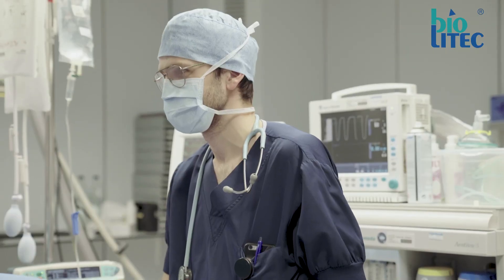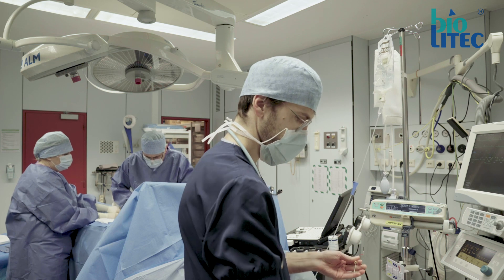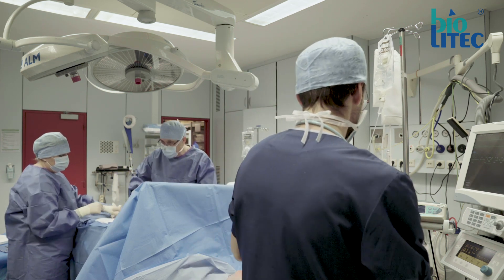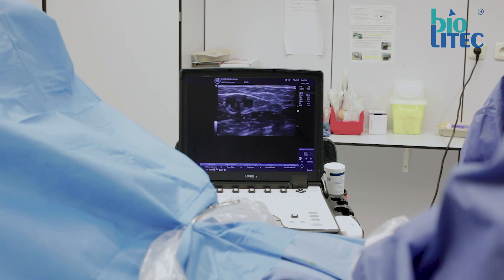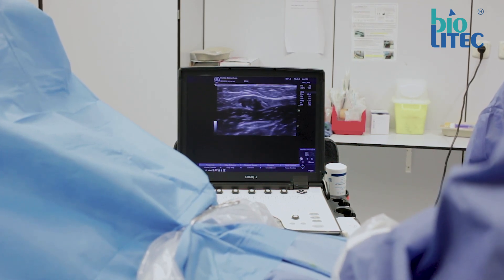In most cases we perform this operation under spinal or general anesthesia, although local anesthesia can be an option too. Peroperative ultrasound is one of the cornerstones of this procedure and, in my opinion, also one of the reasons for the superior results of endovenous treatment.